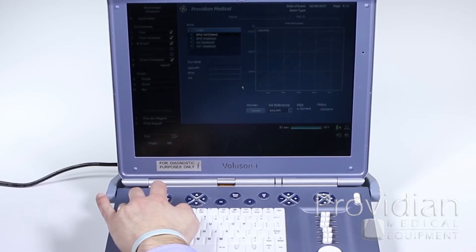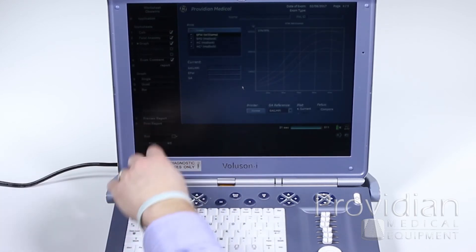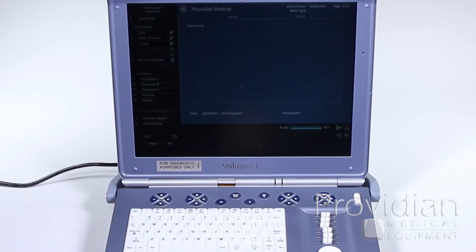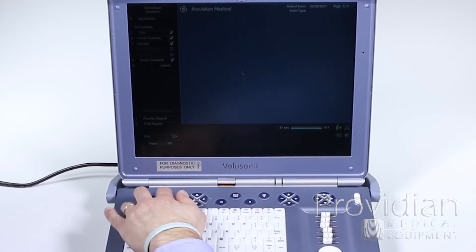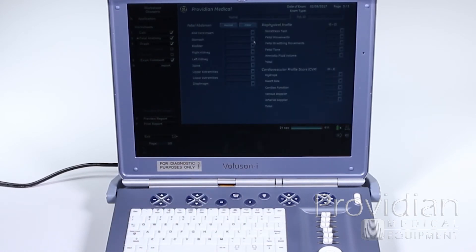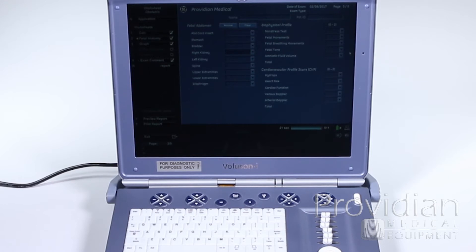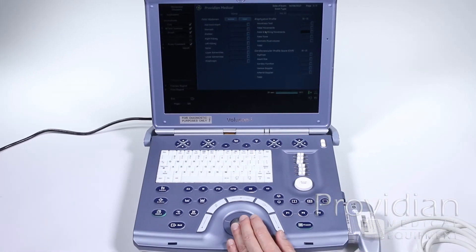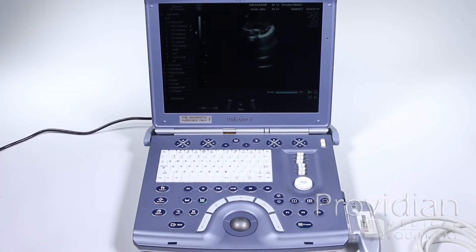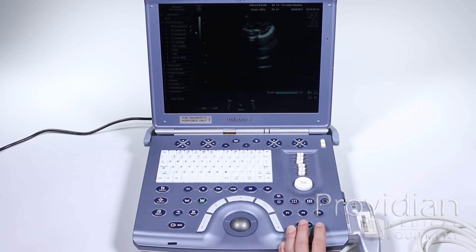You can go through the fetal anatomy here, and it also shows the graphs and the exam comment, so you can exclude or include any of those from the report. You can specify positions like right kidney, left kidney, and it's got a whole bunch of options already set for each piece of the anatomy. Click exit and that report is the same for all the different measurements you'll do — whether it's a vascular report or OB, depending on the measurements made. Let's go into some other types of calculations.